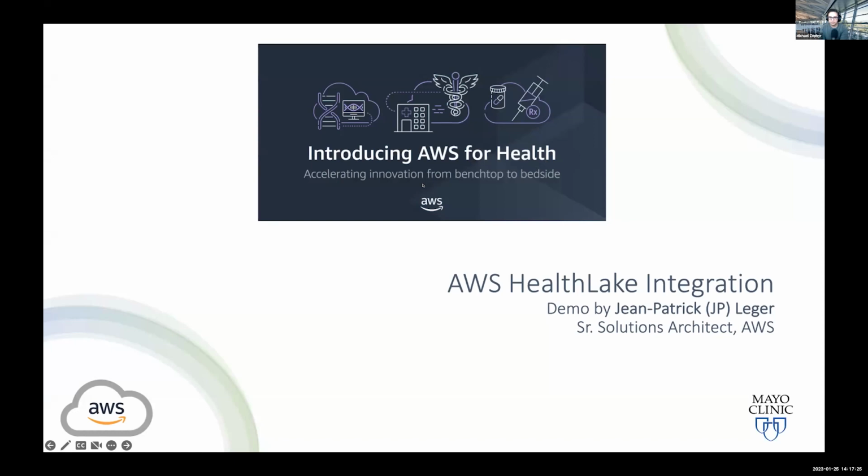All right, I'll give it another minute, see if any other questions come in. Like you said, Vikash, there are those tutorials in the repo. I encourage people to go out and try those. We also have some recordings from previous events on our MONAI YouTube channel. If you go through the MONAI Deploy documentation, there are also some videos within the documentation that walk you through different pieces of everything.